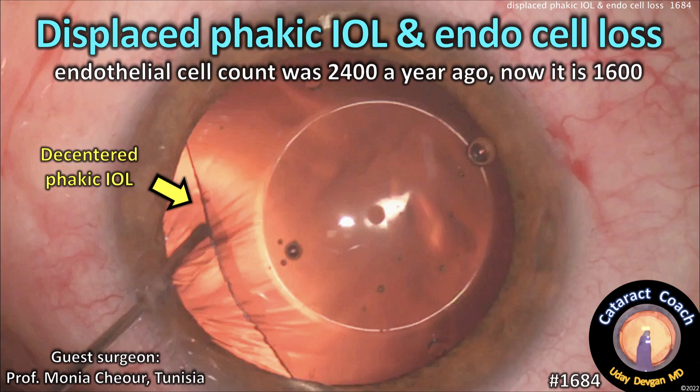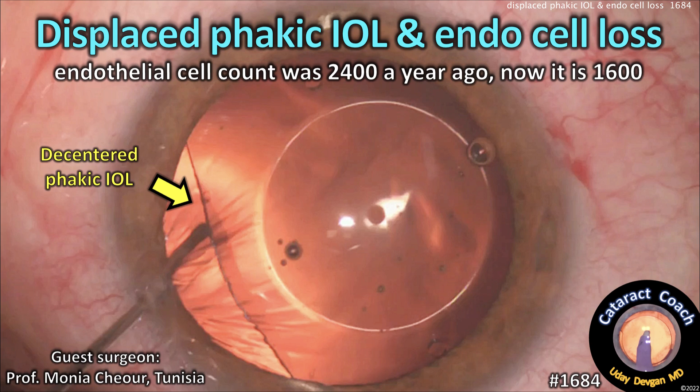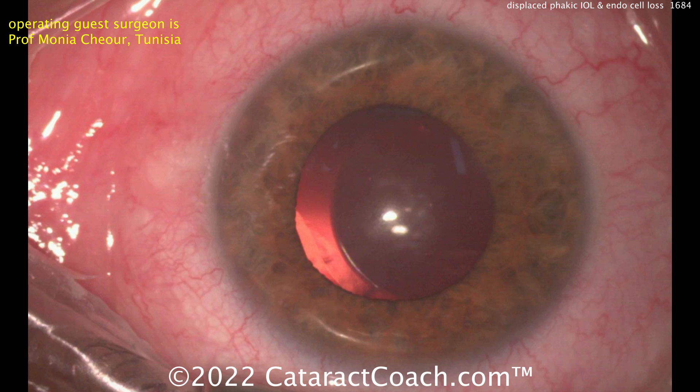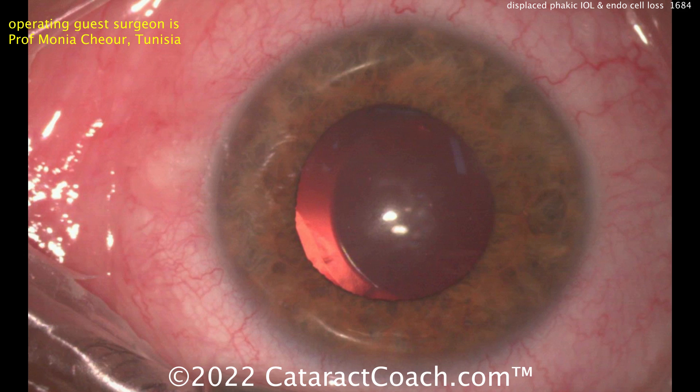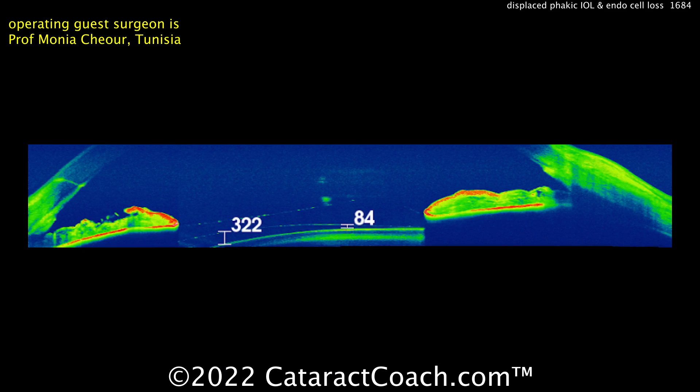CataractCoach.com. Today's topic: displaced phakic IOL and endothelial cell loss. Starting off at 2,400, now it's 1,600. Here's the case — you can see the IOL is certainly de-centered.